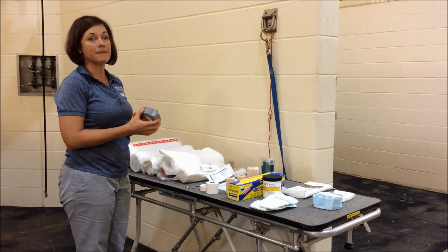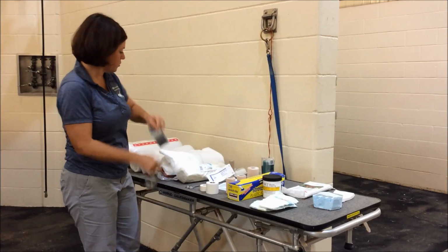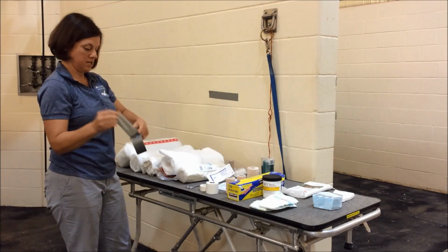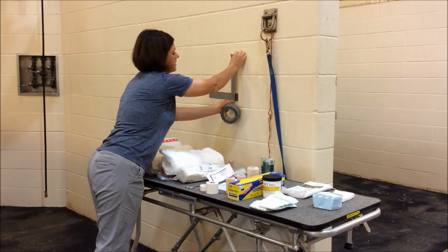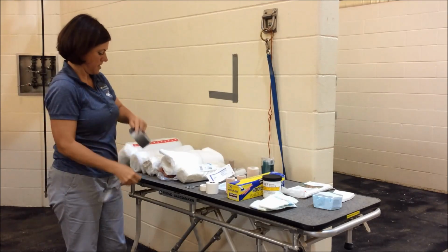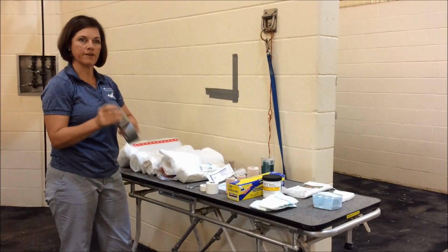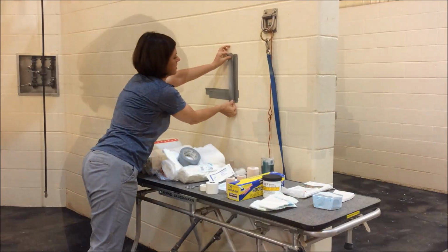So an easy way to apply duct tape to the outer layer of a foot bandage, which not only secures it but makes it waterproof, is to make a grid. So we're going to take strips of our duct tape. Just a flat surface is all you need. One word of caution, duct tape takes paint off, so don't do this on the hood of your car. And I do a basket weave pattern, where I'm just overlapping by 50%. And then I usually start a little bit big and we can cut it down to fit Belle's foot. I probably waste a little bit of tape that way, but it's easier than having one that's too small.